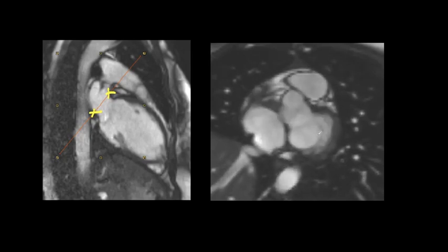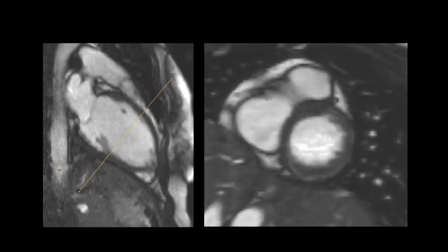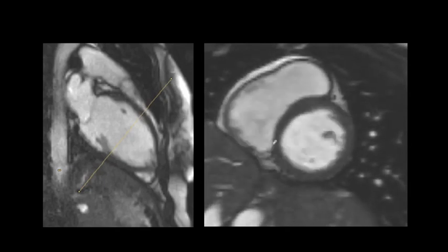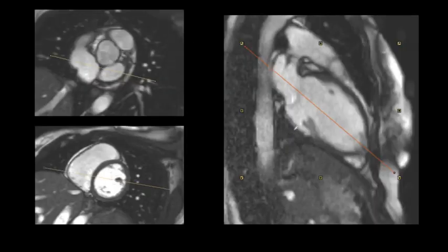To go to the next cine, we need another slice at the mid of the ventricle, which shows us the left ventricle and the right ventricle, and I will explain in a minute why we do this. The reason why we acquire this slice is that next we want to move to acquire our true anatomical four chamber, and we need to use the three images that we acquired to create this.